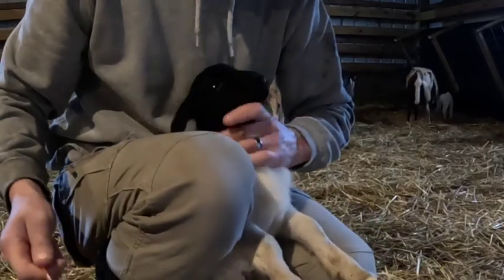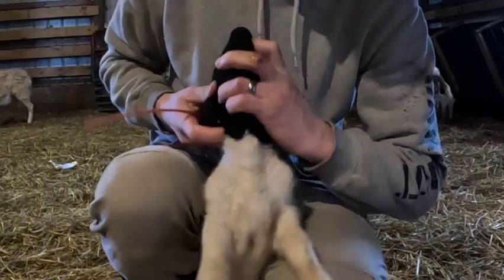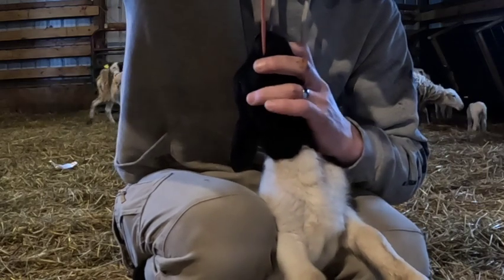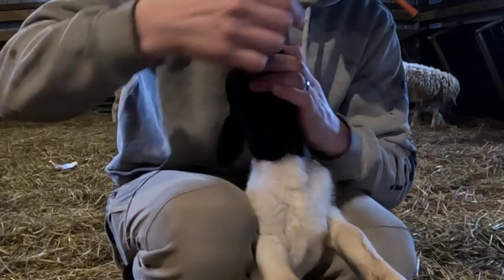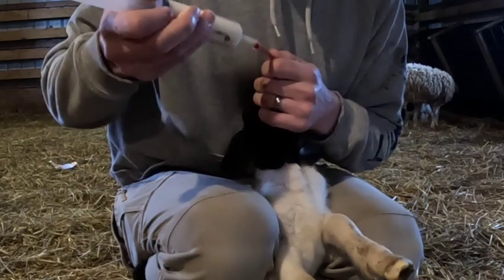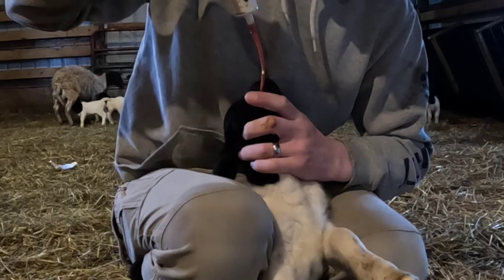What you want to do is get the lamb as straight up and down as much as you can, put one finger in the mouth, straighten the head up so the throat is as straight as possible, then kind of go to the right and down. You can see it going down through there — down about that far. There's a little gurgling sound, a signature gurgling sound, and then we give them the milk colostrum straight into their belly.